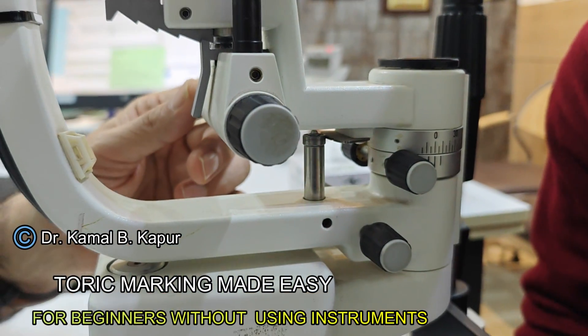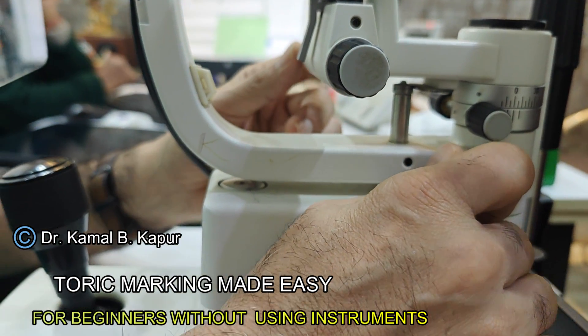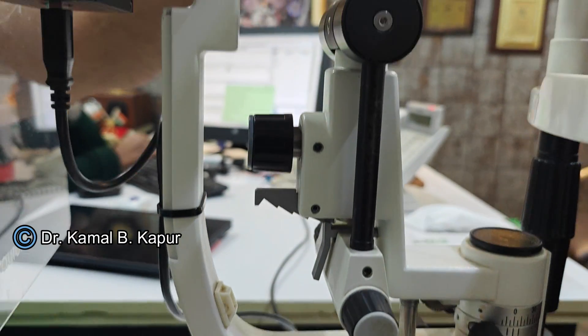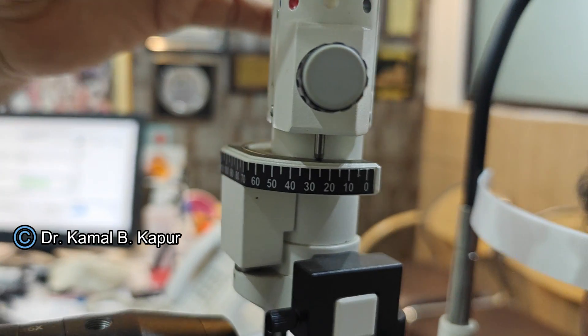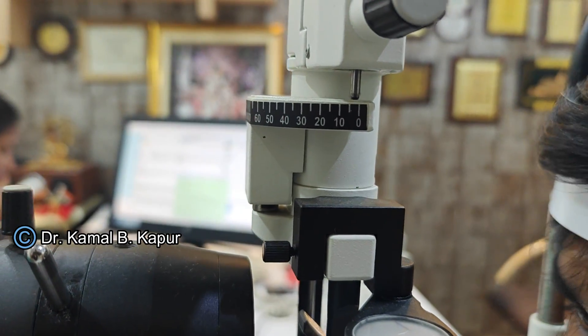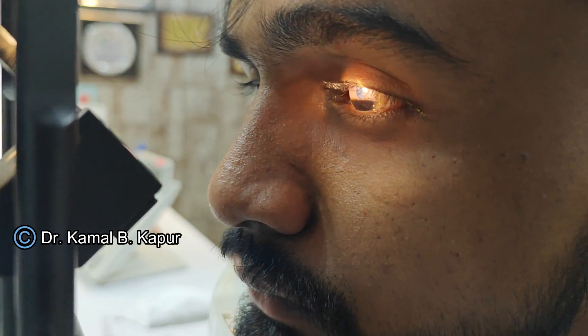Align the first support structure of the slit lamp in the center until it locks, then tighten the screw. The second illumination support is then rotated and locked aligned. Then rotate the slit lamp to 0-180 degrees, ensuring a thin and the longest possible slit beam — you need a thin beam to get a more accurate result.